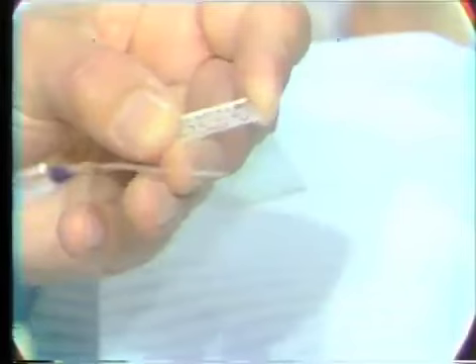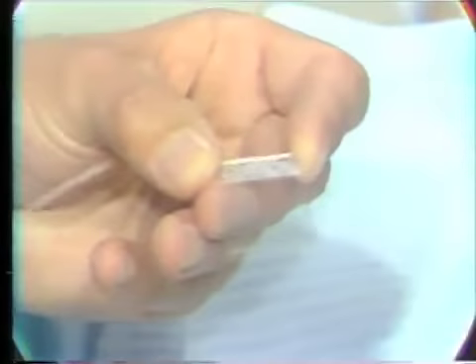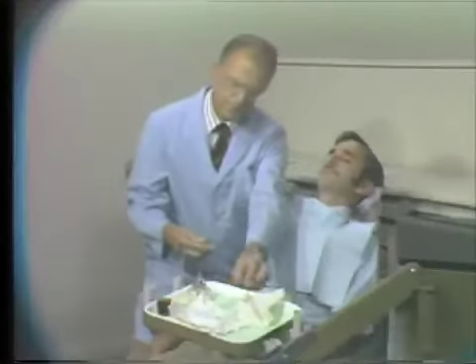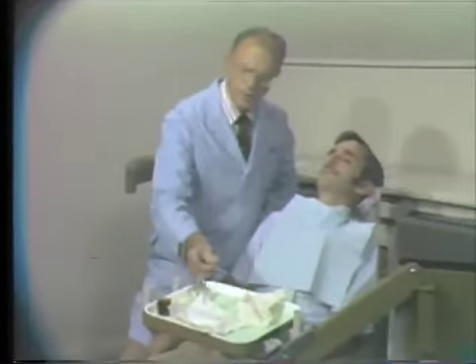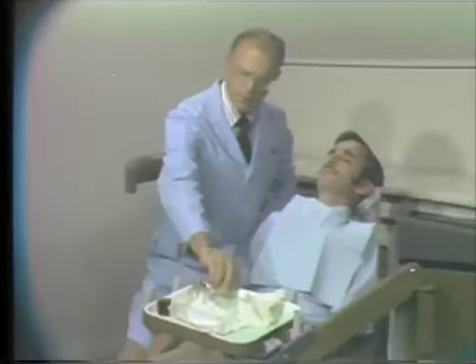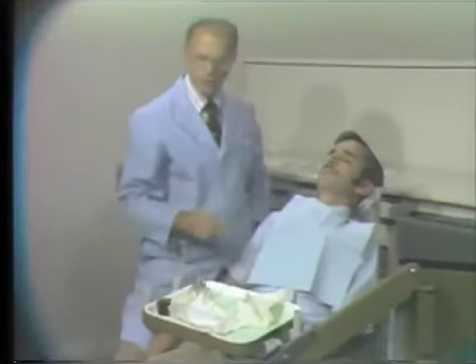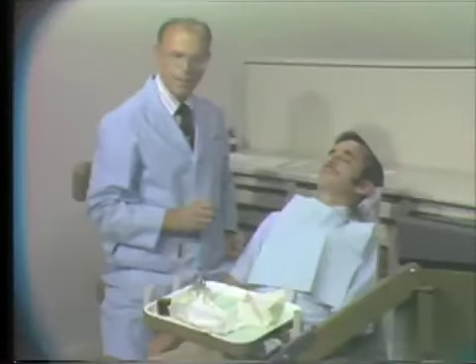In order to get a more even and wider distribution of material, it's possible to place a small drop of water or physiologic saline, which has been sterilized previously, on the slide to facilitate the spreading action. The loop is again sterilized by flaming to destroy any pathogens that may be adherent to it following the removal of the specimen from the mouth.